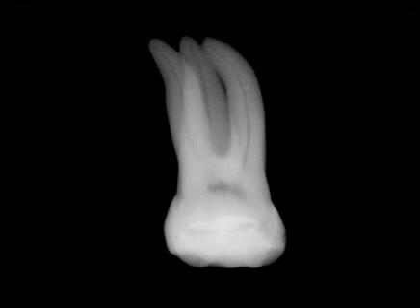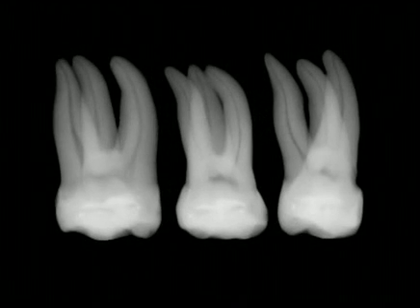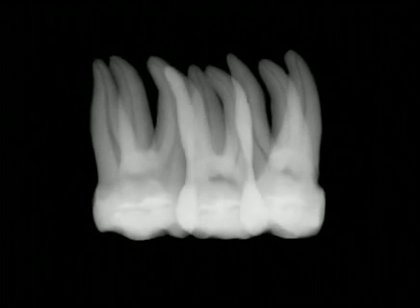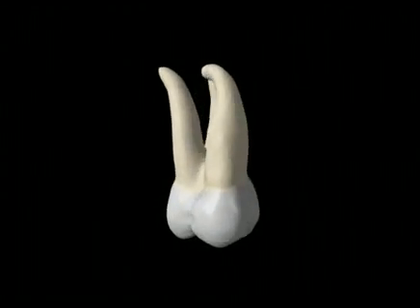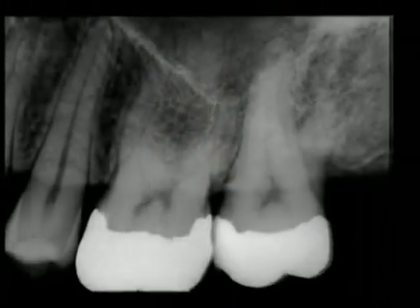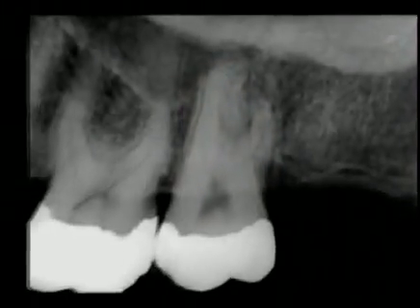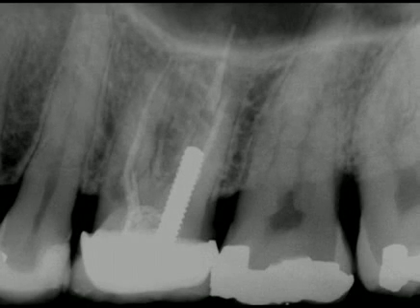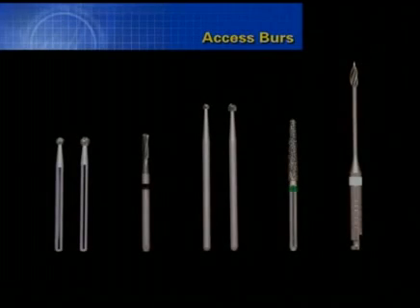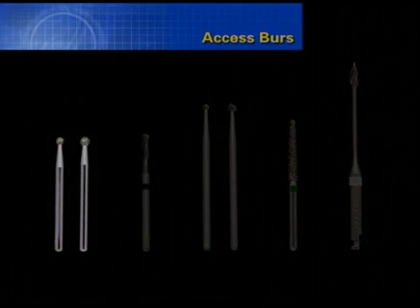These views will better prepare the clinician for root canal treatment. 3 films, in combination, are more valuable than a single film alone and give us important information as to the buccolingual dimensions of a tooth and root concavities. Importantly, preoperative films show us the length and diameter of a post and if the post is centered in the root canal.